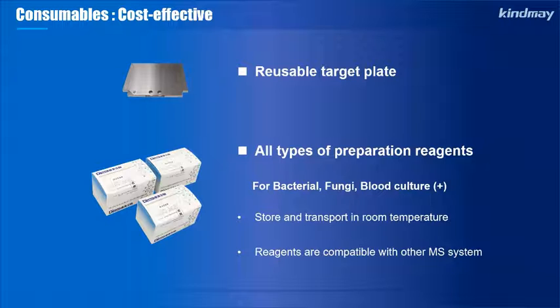Yeah, for this one, no, because for the database, it's a closed system. But our answer is our reagent can be compatible with the bioMérieux machine if they have the same bacteria and fungi. Okay, I got it.